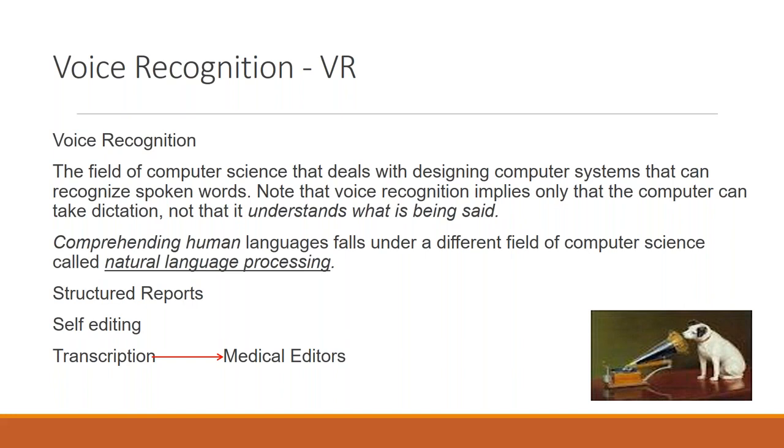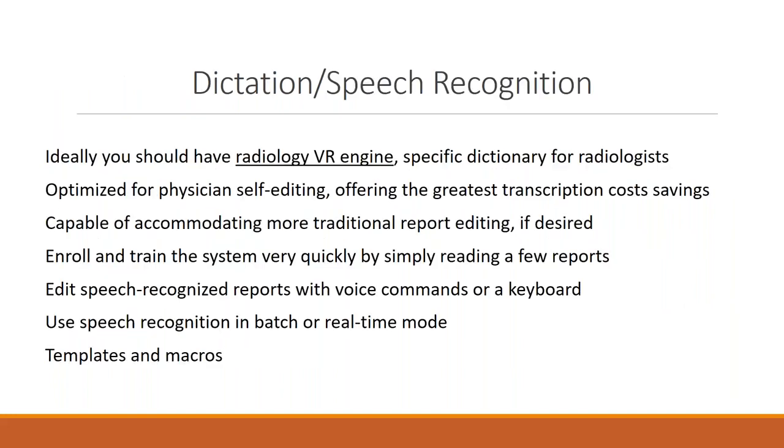And sometimes they lock the system down after they've tested, so when they come back in on live day, their login doesn't work anymore. So make sure you know from the vendor when they've made that system lock and system change, because the last thing that is wanted on the day of go-live is everybody logging into the system and that login they did during their testing doesn't work.